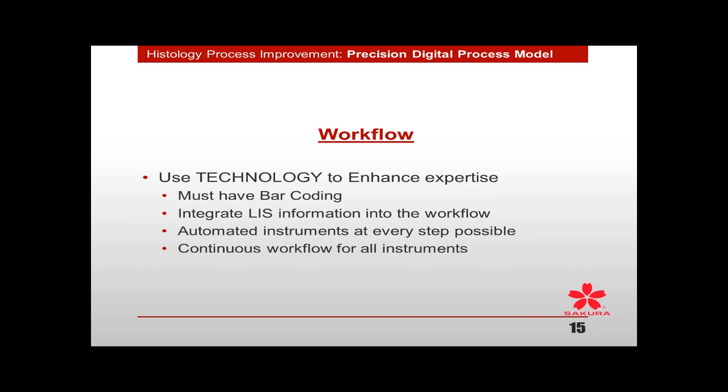And again, you have to have automated instruments at every step possible. You just don't have time to be doing other manual things because with loading and reviewing, you're going to be spending some manual process time there. But it will be valuable time spent. So if you can find other automated instruments in the total process, whether it's an H&E stainer, a special stainer, an IHC stainer, how you do your processing, an automated embedder, anything that can help, it's going to allow you to then reallocate the tech time from that into this digital process.